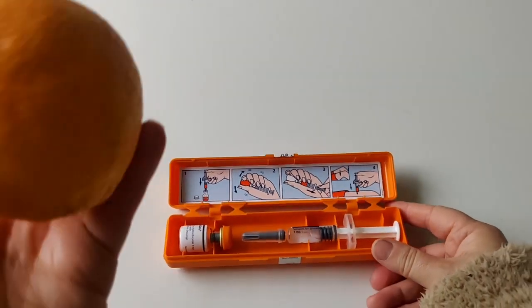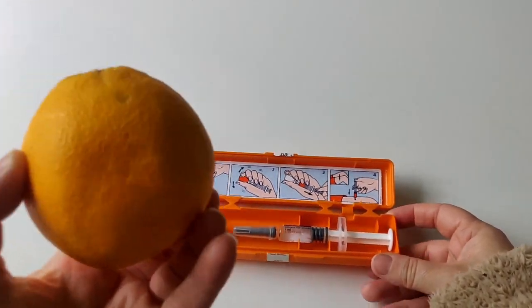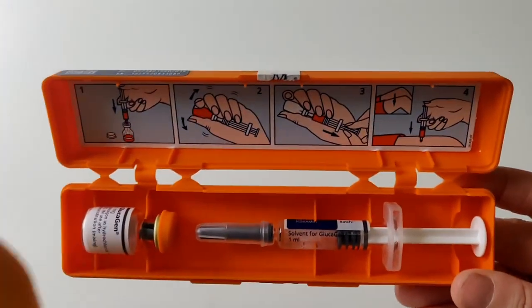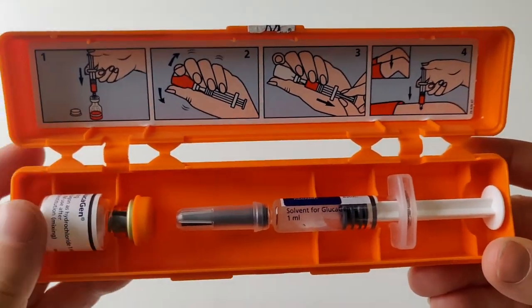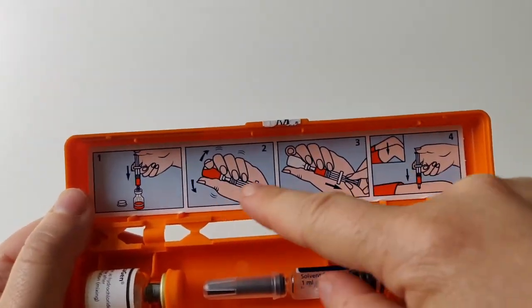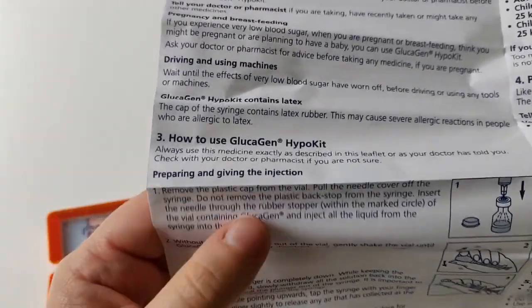For the purpose of this demo I'm going to inject an orange — obviously throw away the orange immediately afterward. I learned this technique when I was first learning how to take insulin; people practice injecting into oranges. Make sure you throw the orange out because you do not want to eat it. I'll be following the very detailed instructions from the leaflet alongside the quick picture guide.